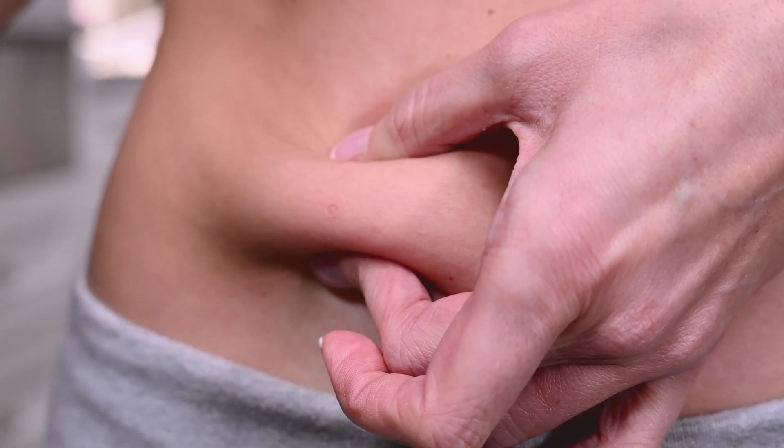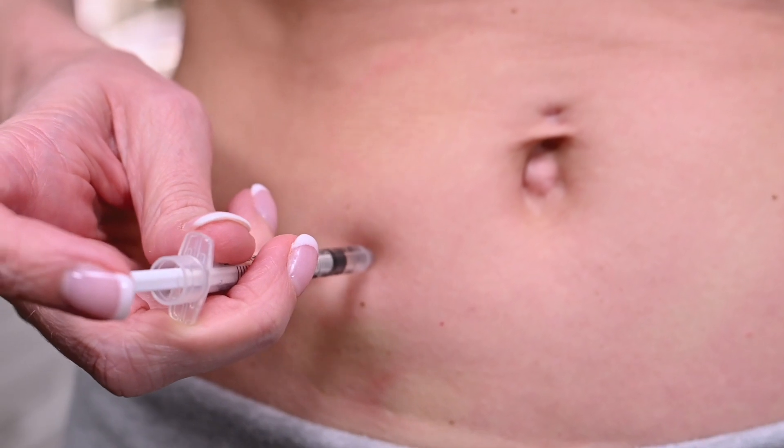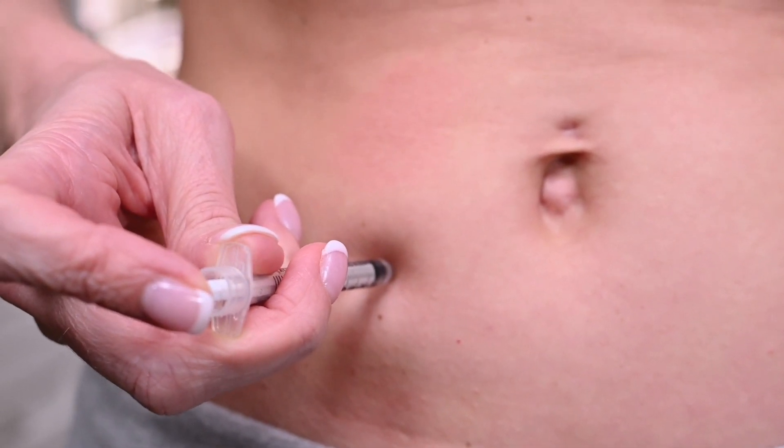Hold the syringe in your preferred hand, pinch a fold of skin between your fingers, and insert the needle at a slight angle. Release the skin after the full length of the needle is inserted. Push the plunger until all the medication is administered into the injection site.